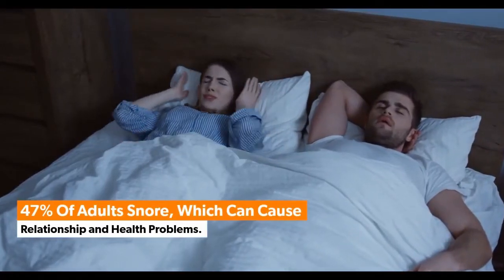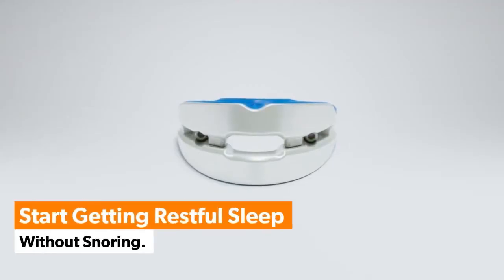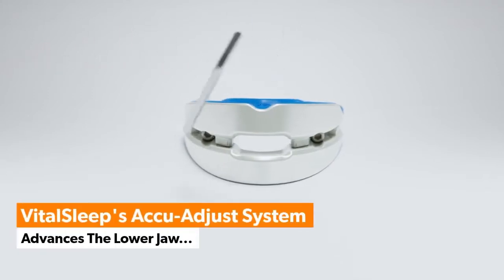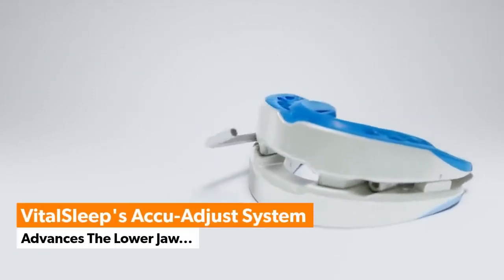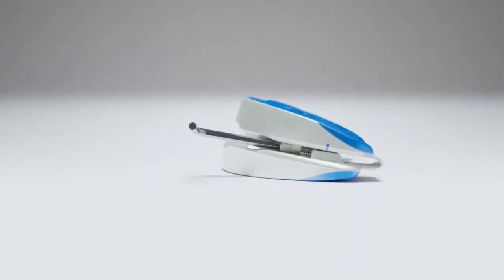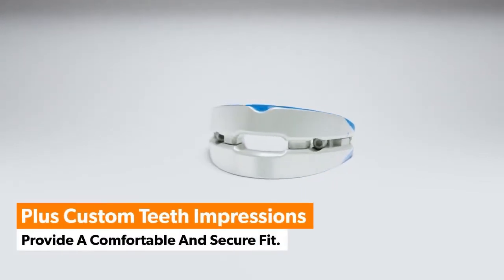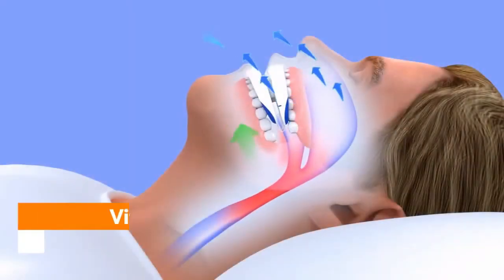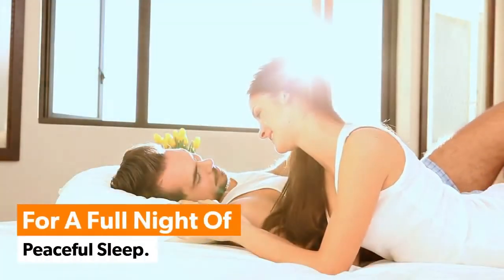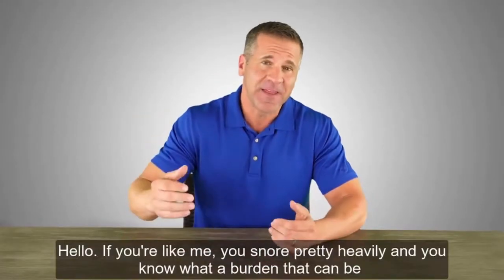47% of adults snore, which can cause relationship and health problems. Start getting restful sleep without snoring. VitalSleep's AccuAdjust system advances the lower jaw for improved breathing and quiet sleep. Plus, custom teeth impressions provide a comfortable and secure fit. VitalSleep opens the airway and reduces snoring for a full night of peaceful sleep.